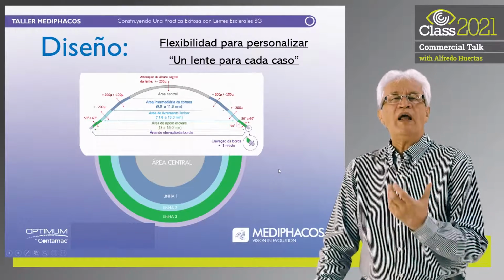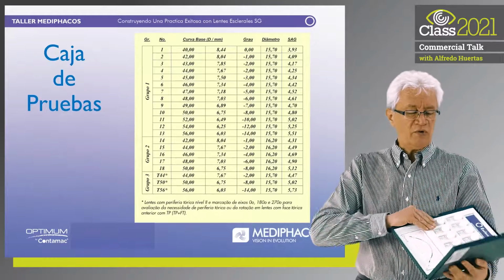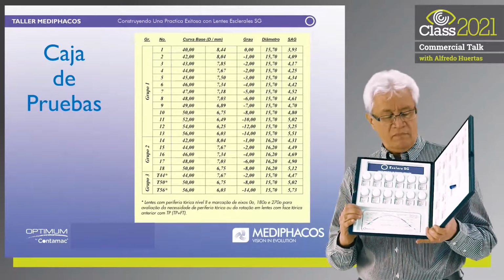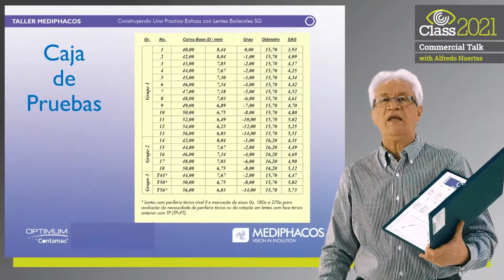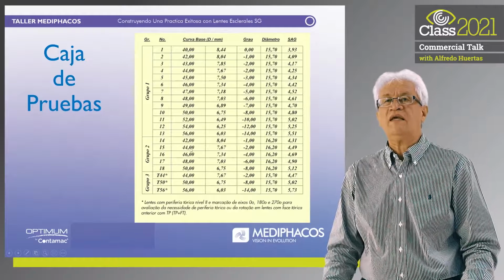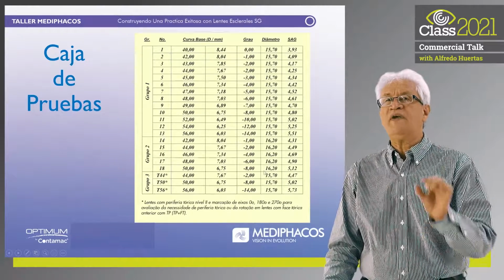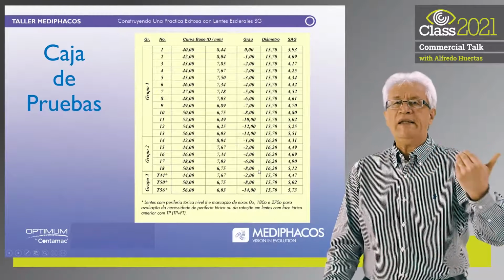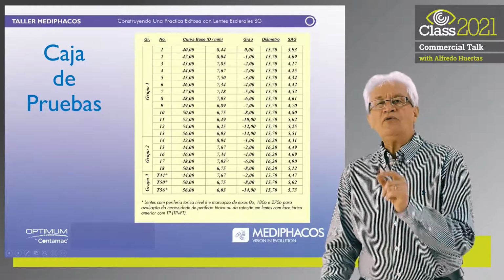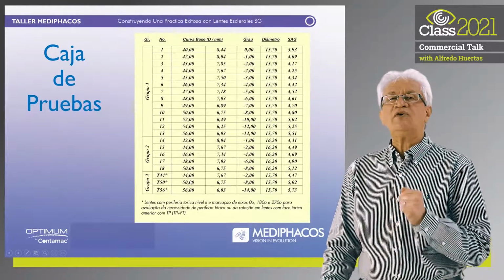Here we have the test box that comes with a laminated manual book type binding. You can see here that it is divided into 3 groups. We have first a group with a 15.7 diameter lens. The second with 16.2 diameters, and it is worth noting that between groups 1 and 2, we have a way to correct 70 or 80% of the cases of corneal irregularity or corneal ectasias that we could handle. In the third group, we can see some lenses that we call the T44, T50 and T56.